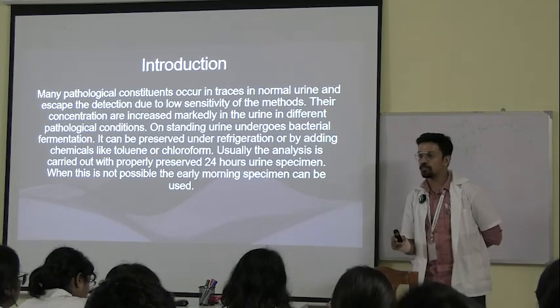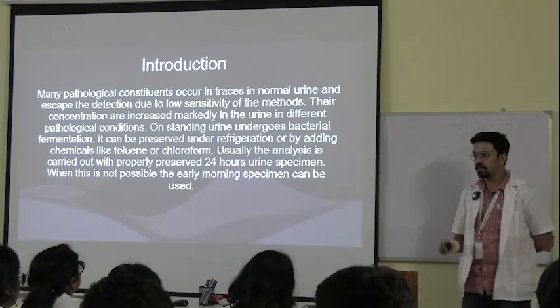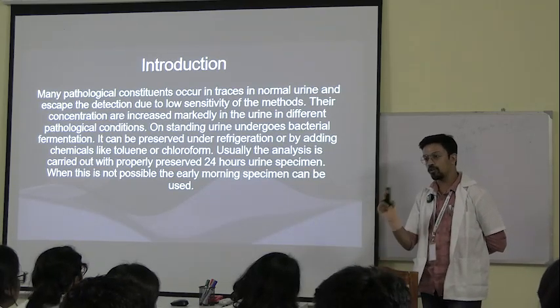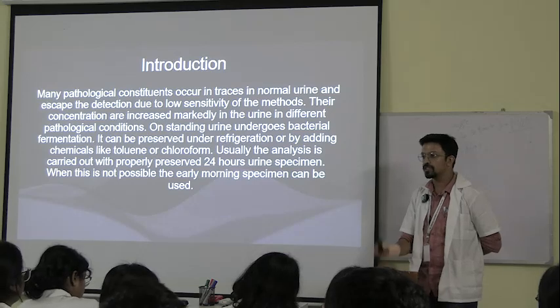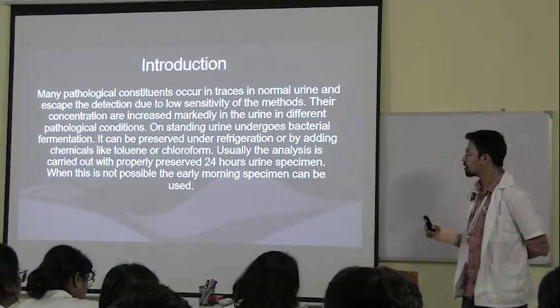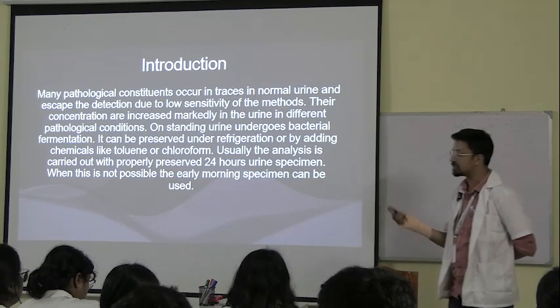If the Benedict test is coming positive, there could be some other reason as well, not always because of reducing sugar. There are some other substances in the urine that can also give a positive result. So this is not specific. The specific one is the example of Rothera's test. Okay, that is the meaning of specificity.